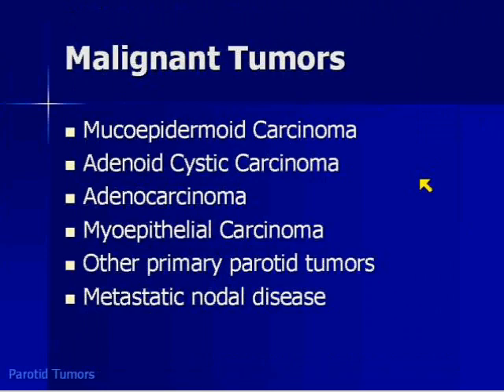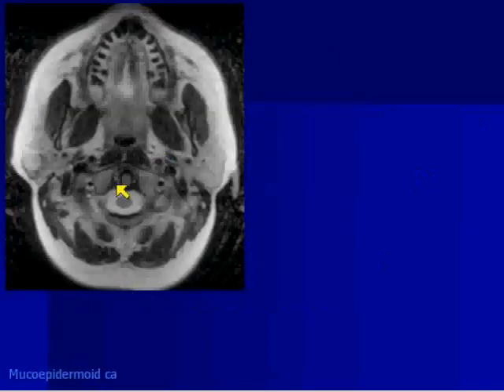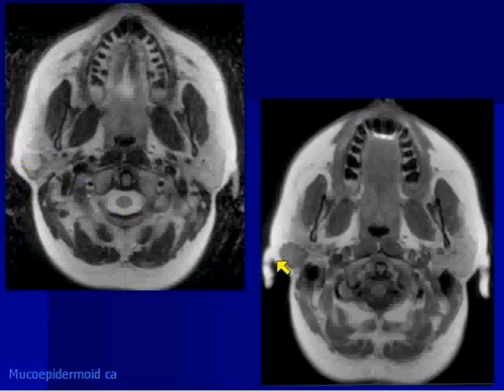You also have malignant tumors of the parotid gland as well as nodal metastases. Although they can be bright on T2, they're generally not bright like a light bulb. It's the benign mixed tumors that are just screamingly bright. But don't be fooled — mucoepidermoid can fool you sometimes. Because it's mucin-producing, this mucoepidermoid carcinoma of the parotid is relatively bright, almost as bright as CSF. So odds are a bright, well-defined lesion is a benign mixed tumor, but it can be other things as well, and they just need to take it out.